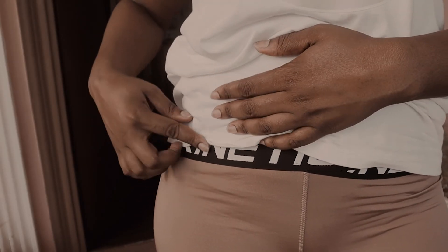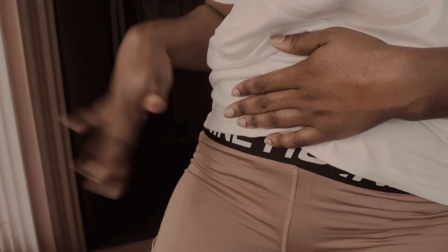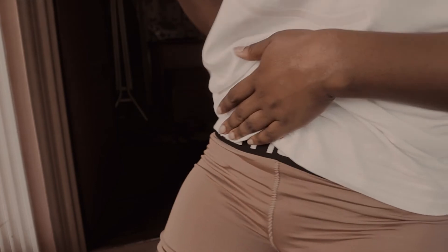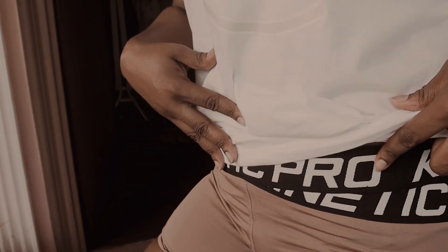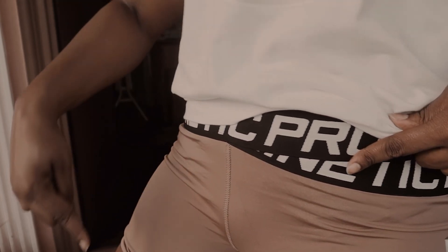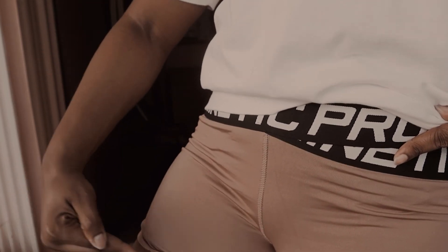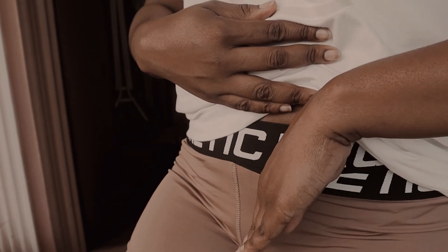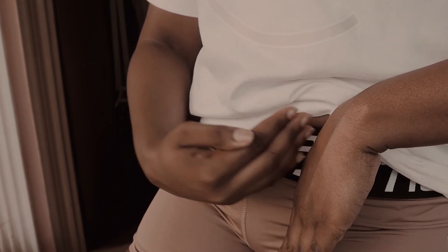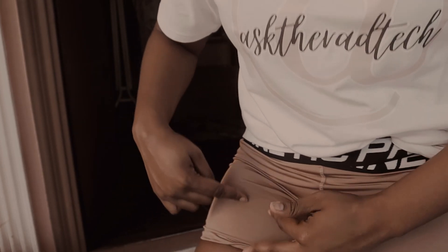This is my hip — I already demonstrated this before but I just want to give reference. This is me with my leg turned to the side. You turn the leg to the side, angle the patient halfway, and once you're centered, the collimation box will follow the length or direction of the femoral shaft. It will come down this way and up across this way, and the medial border of the collimation light will pass through the region of the symphysis, making sure you have your hip joint captured inside — so you don't happen to mistakenly nip the acetabulum.